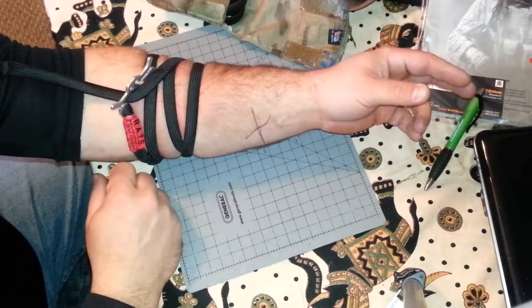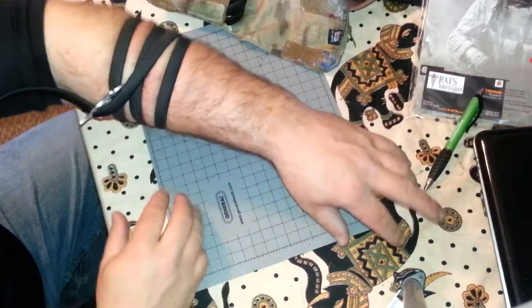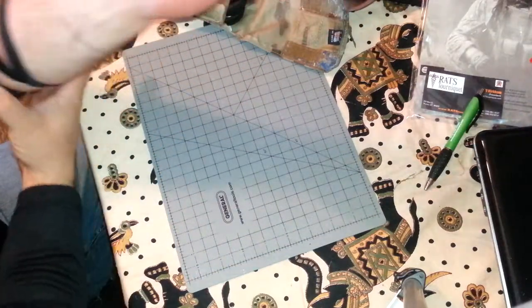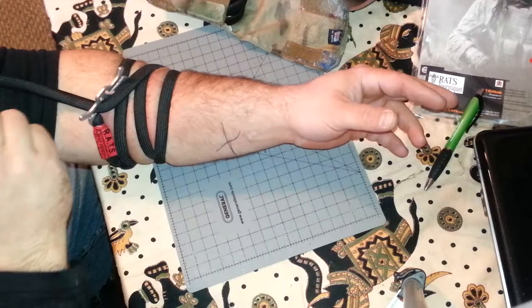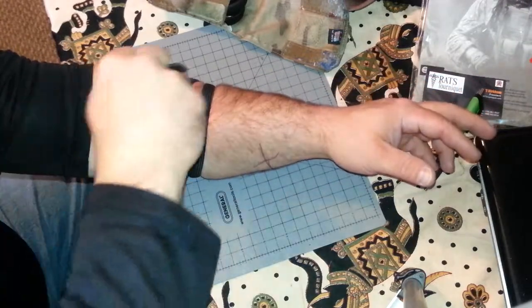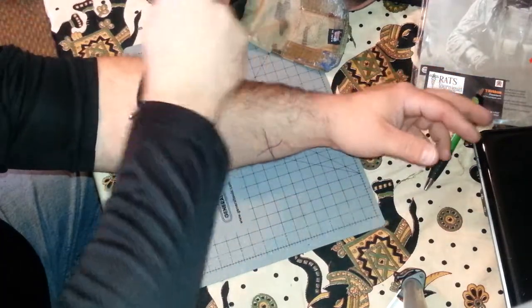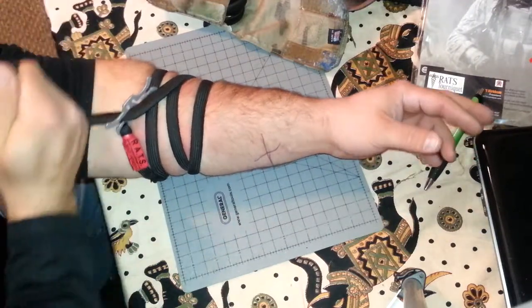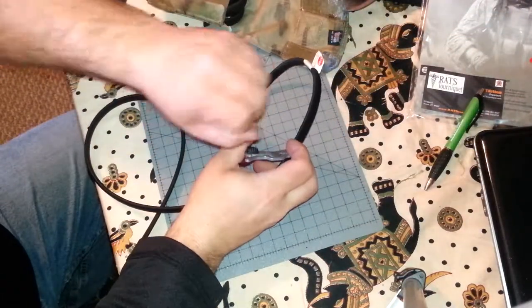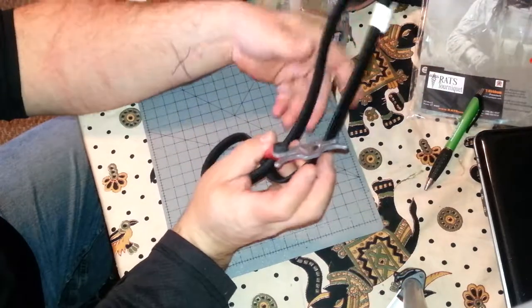With a windlass I might still be going tightening it down — it's already been over a minute. This is quick. The really nice thing for training is you can do it over and over without destroying the bands. Look at that wide strip — from here down there's no oxygen, no blood flow coming in. To remove it, if you're concerned about it coming off, loop it through one more time. To release, pull it out from the cleat under tension.